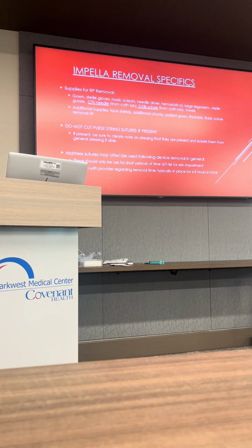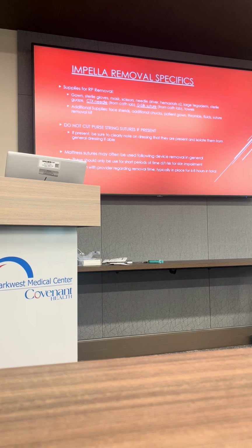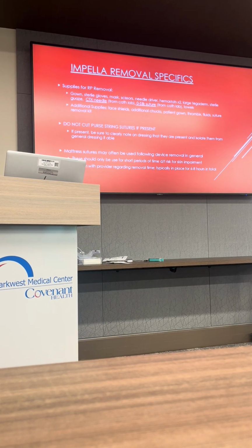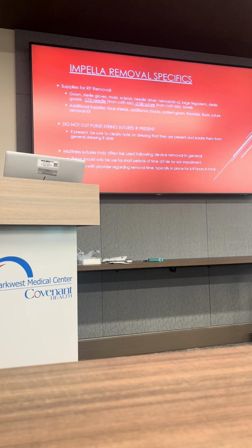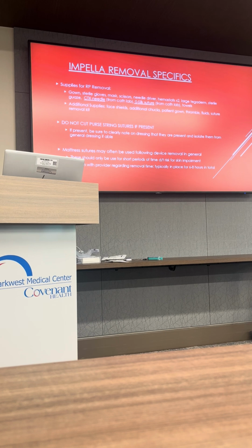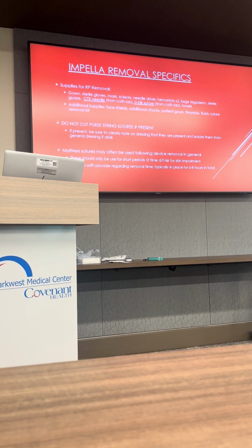And so it kind of invalidates the whole reason why you have it there, because if you pull the locking suture before you get the knot down to the vessel, then you lock it in the track and you can't really push it down to the vessel at that point. So that's the kind of rationale for why.